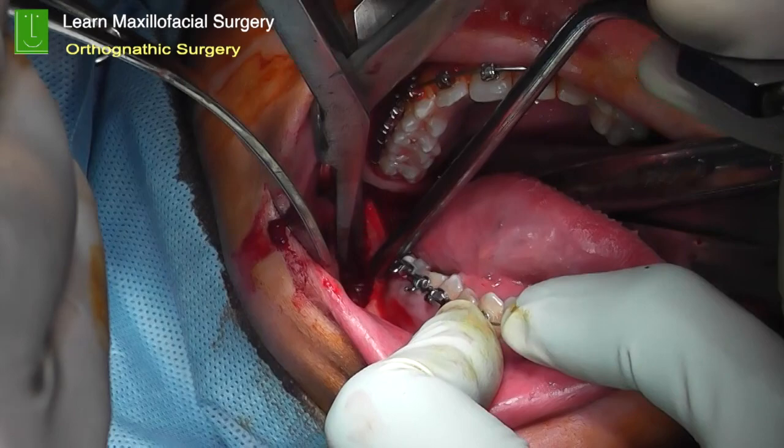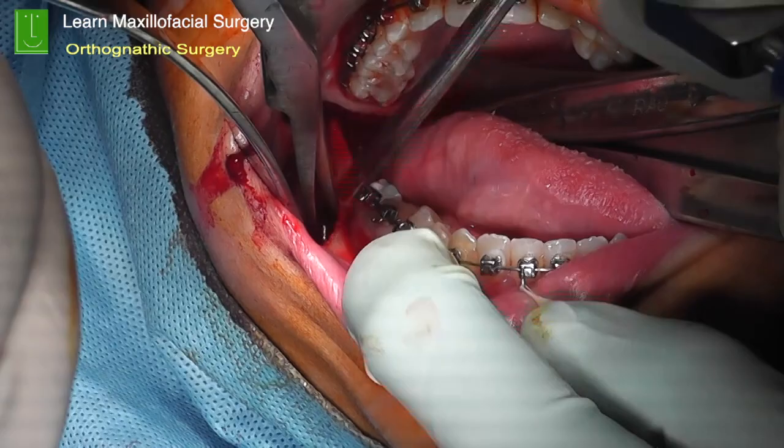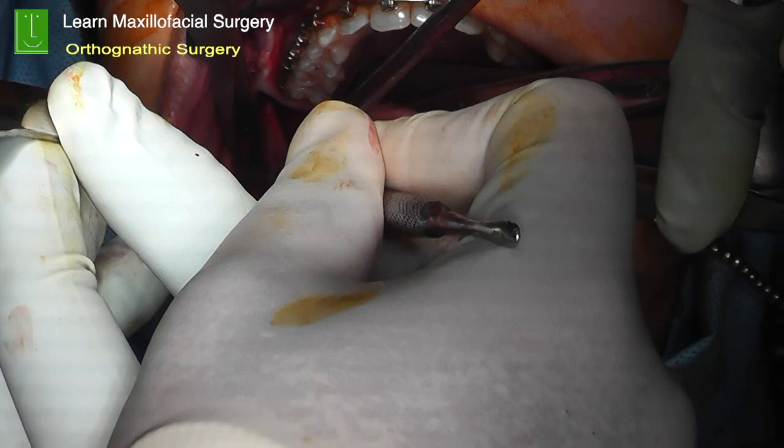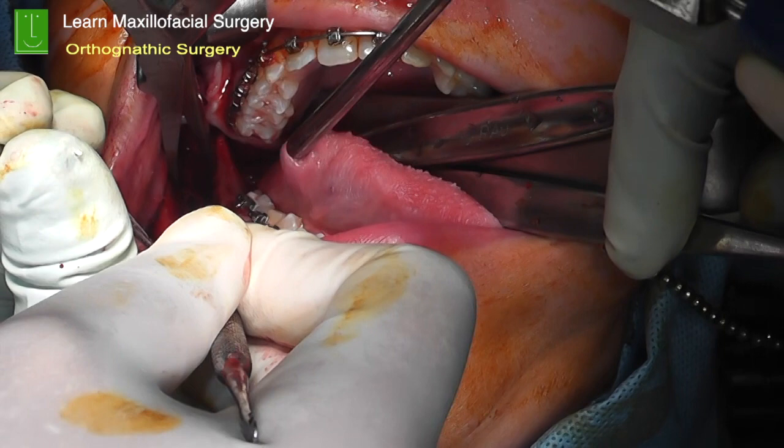And then once you get the springing effect, then you can use a Smith spreader. This is again a very useful tool to spread very, very gently. Again, you can see that finger pressure alone can be used to split the bone. So the split really happens in such a way that you don't suddenly snap the bone apart, but you need to do it gradually.